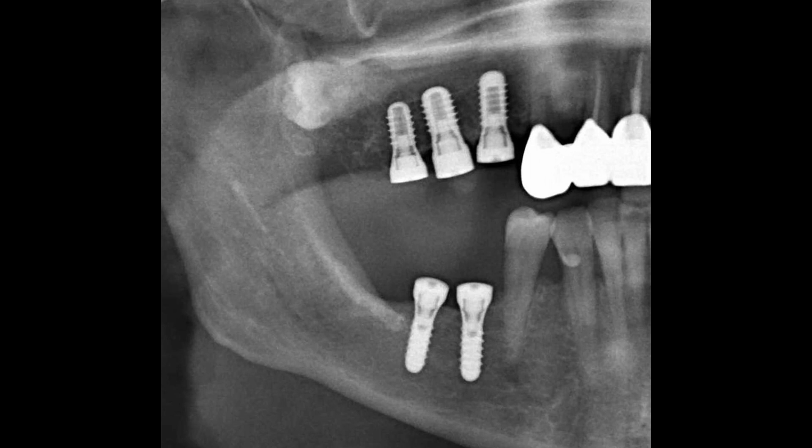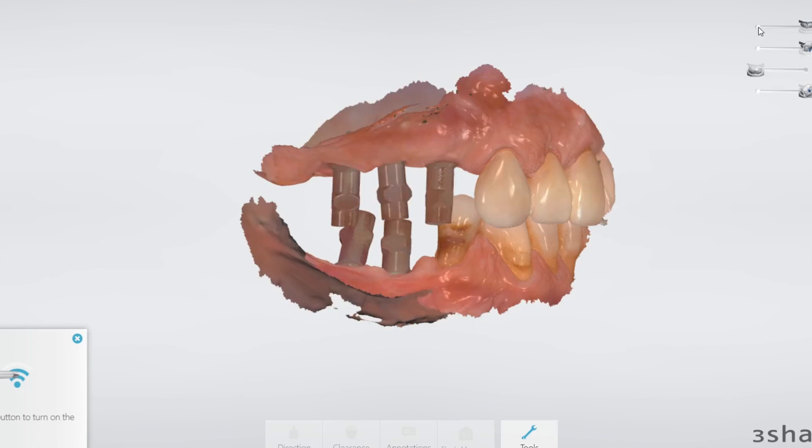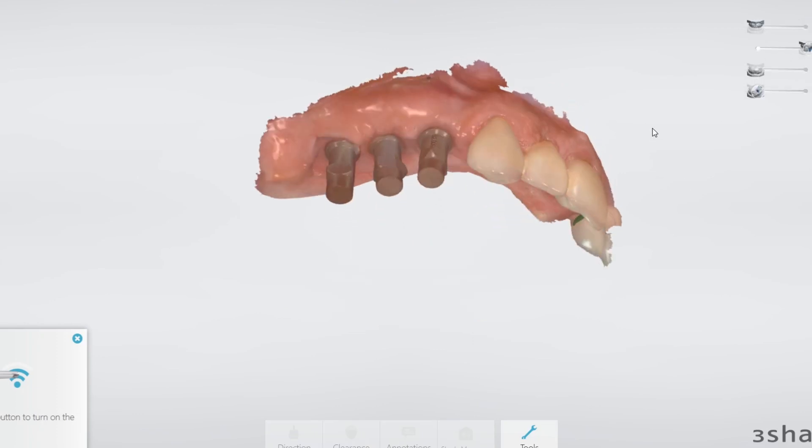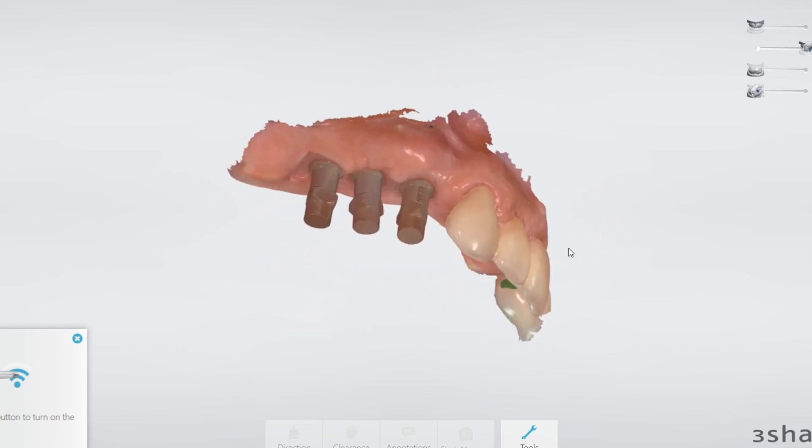We gave the site three to four months to heal and then we got the patient back and took a scan. Here's our TRIOS scan and we're satisfied with the parallelism of the scan bodies.